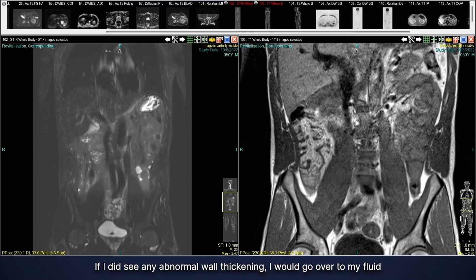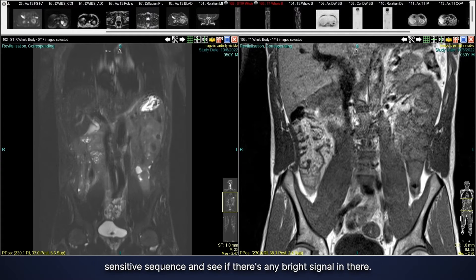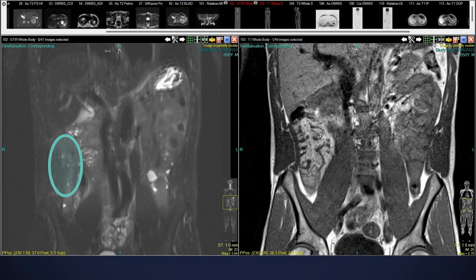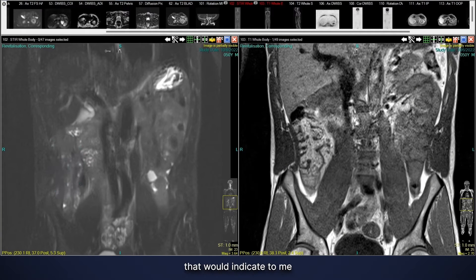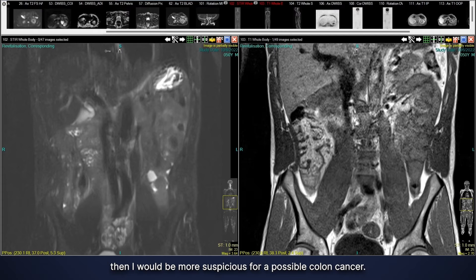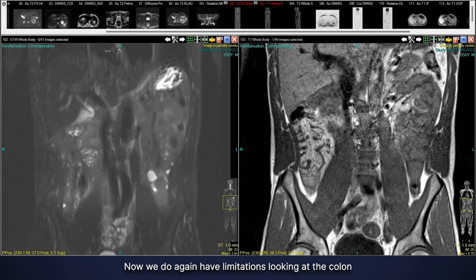If I did see any abnormal wall thickening, I would go over to my fluid-sensitive sequence and see if there's any bright signal. If I saw a really bright signal, that would indicate an inflammatory process going on. If it looked like a gray signal on this sequence, then I would be more suspicious for a possible colon cancer.